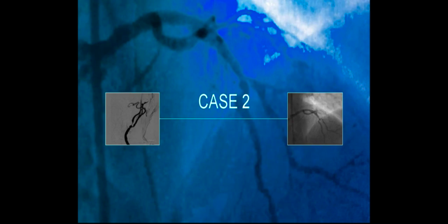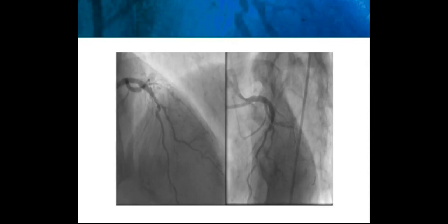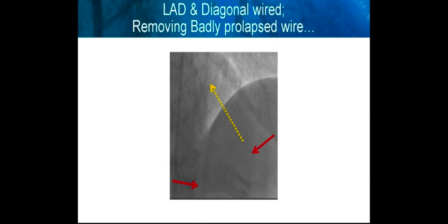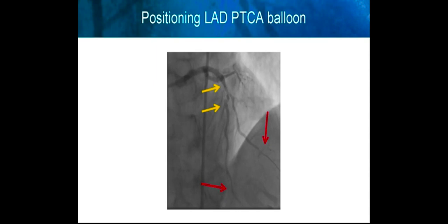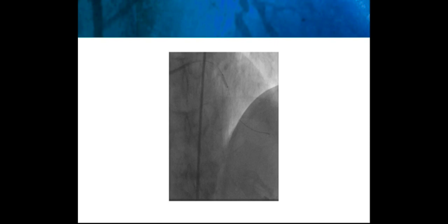Our second case — a little bit more challenging bifurcation with some other pointers. Here you can see a typical LAD diagonal bifurcation, a little bit more disease in the diagonal, a little bit more angulation. Learning a lesson from the first case, notice how that first wire was pretty prolapsed. Rather than trying to redirect a badly prolapsed wire, we used that as a buddy wire, put a second wire into the diagonal, and now we have a good wire in the diagonal. With two wires we prep the LAD — there's our balloon for preparation and positioning. Here is the angioplasty in the LAD, and now we do our preparatory angioplasty in the diagonal while assessing LAD preparation. And there's our balloon angioplasty of the diagonal.